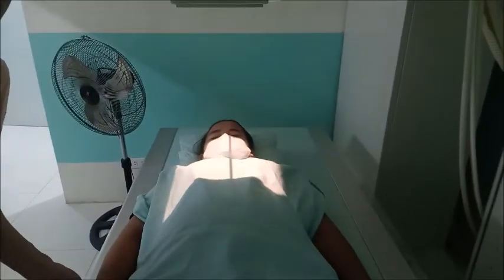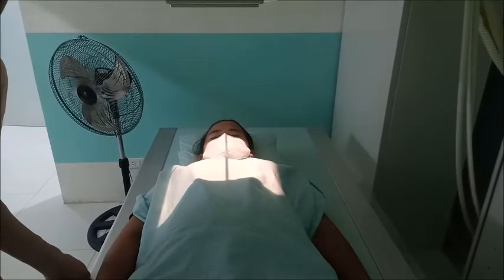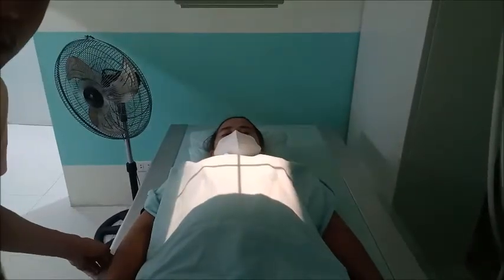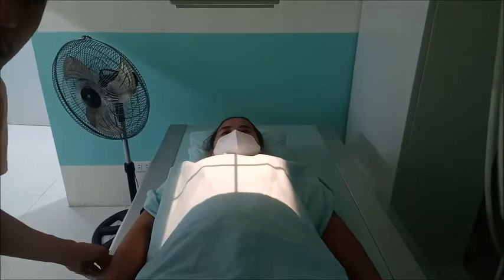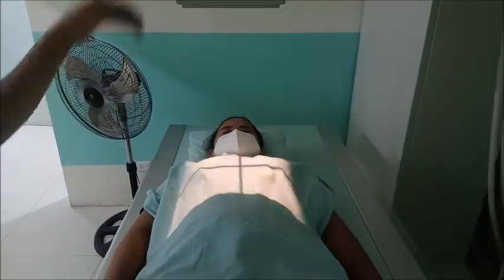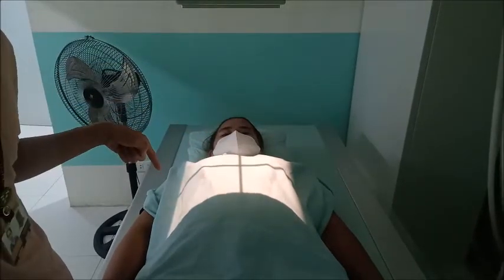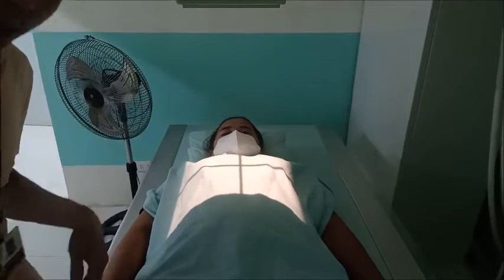So, what to do? Instead of moving the patient, again, atong table is movable. So, move the table until such time that the patient's MSP, MSP yung mention ganyan. MSP dito. MCP, ito sa lateral. MCP, maganda sa lateral. Nagkurang na ito. Ang MSP ko. So the center, the MSP of the patient is also at the center sa to ang central ray kani siya. The vertical niya nga portion. So question kani isa, asa man siya dapat nga level? So asa man in between sa atong T1 up until the T1 to T12. So narag hapon siya kan T number 7.